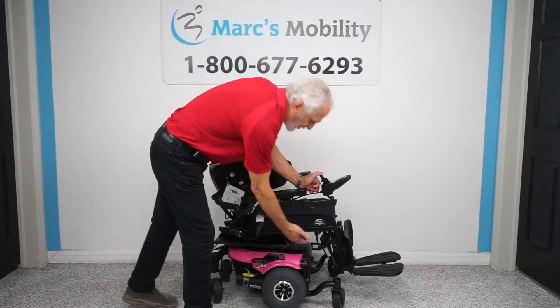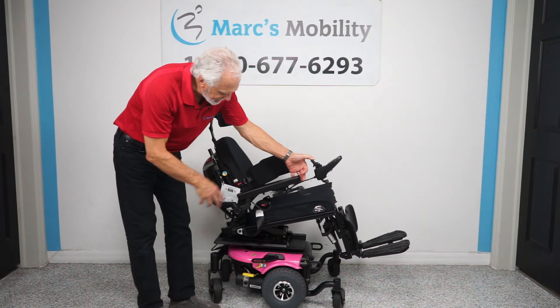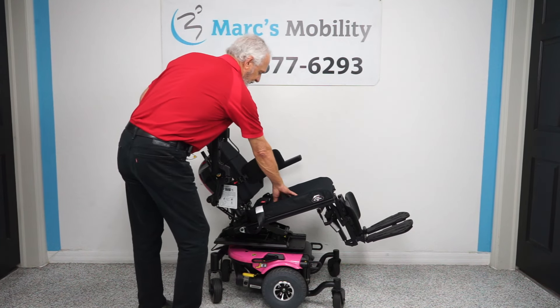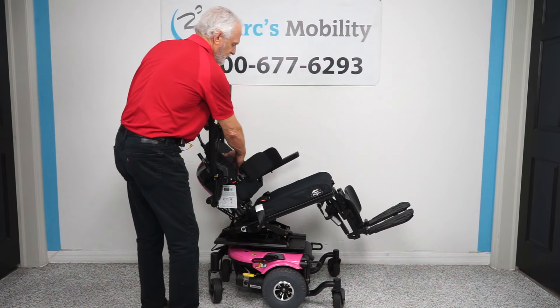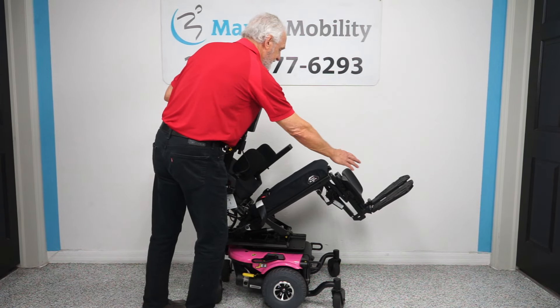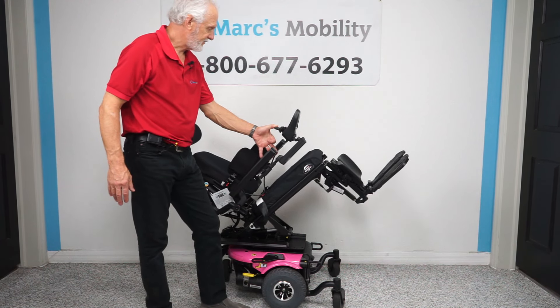Tilt is when the base goes back — it takes the legs and the back because they're all connected together. This is called electric tilt. If you need to have pressure release off your bottom, pressure off your back, you just want to relax, or you want to get some good circulation in your legs, this would be a really nice way. This is the electric tilt.